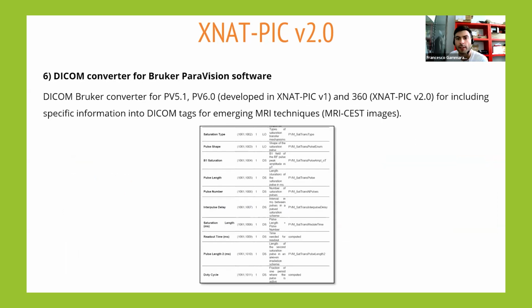And XNAT-PIC version 2 supports the converter for Paravision 360, and we have added some private tag for emerging MRI techniques, and the picture shows you the private tags.